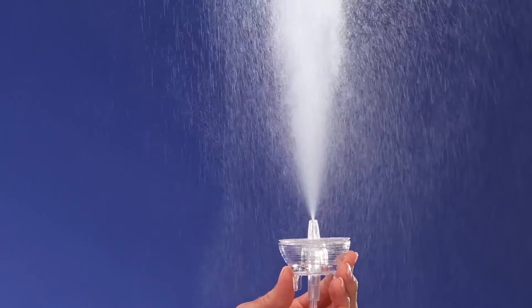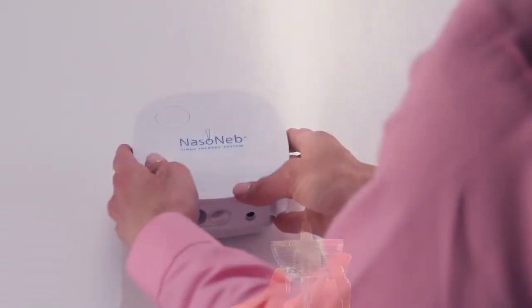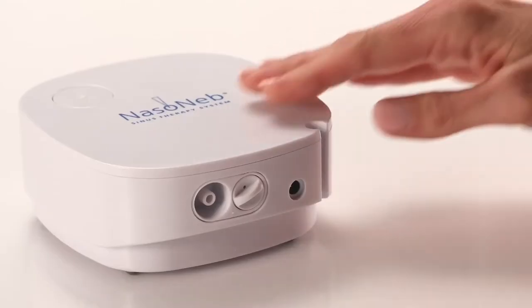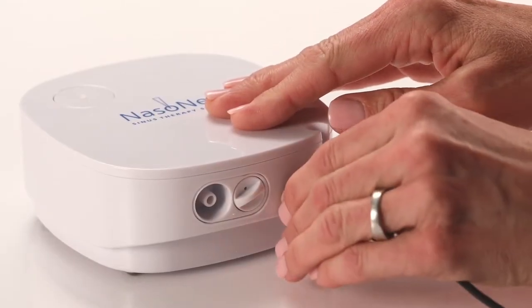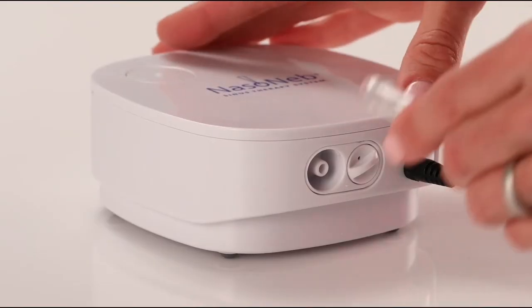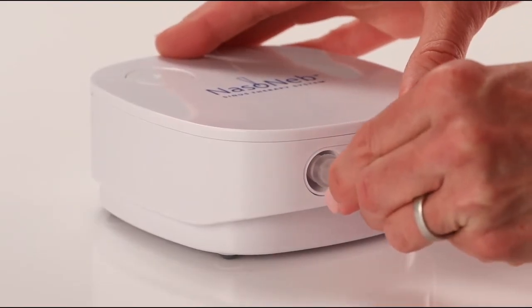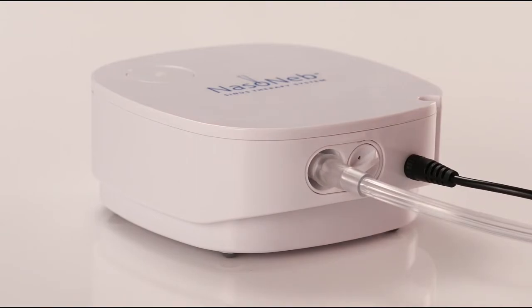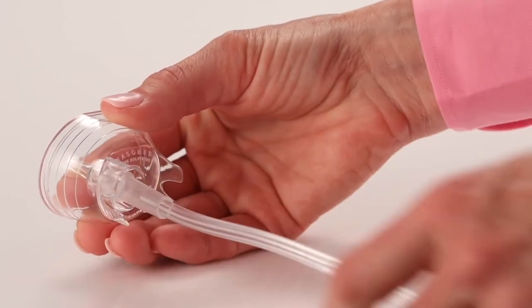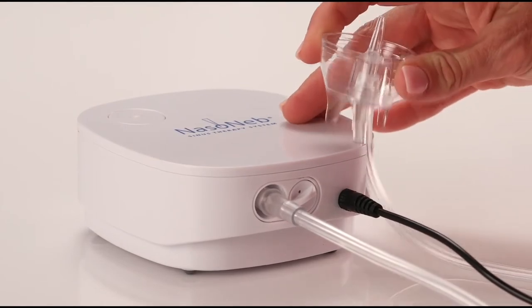To use the Nasoneb Sinus Therapy System, place the compressor on a flat, dry surface, preferably next to a sink with a mirror, and plug the compressor into a wall outlet. Next, attach the supply tubing to the output of the compressor. Now, attach the supply tubing to the air inlet of the cup. Place the cup into the holder on the compressor.